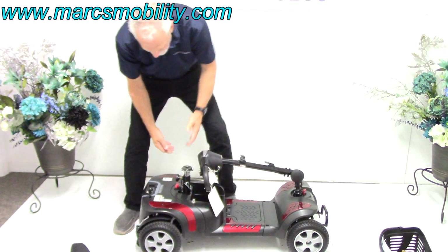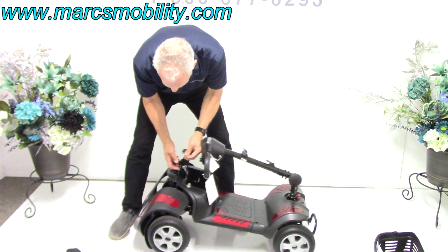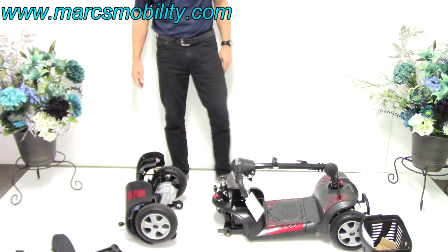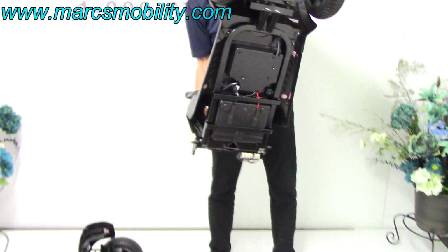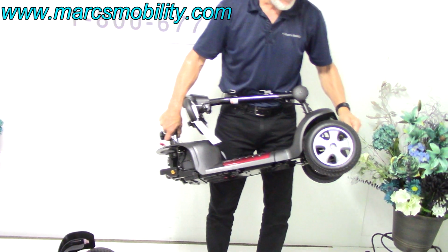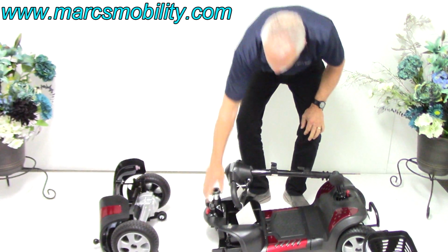So if you pull that lever and pull the pole at the same time, you notice how, and then make the back go on its back like that. Okay? So this is the front end right here. This is your front end. This is about 40 pounds, okay? Because it's a 4-wheel scooter. That's your front end.